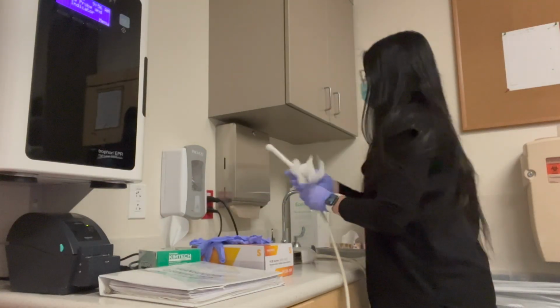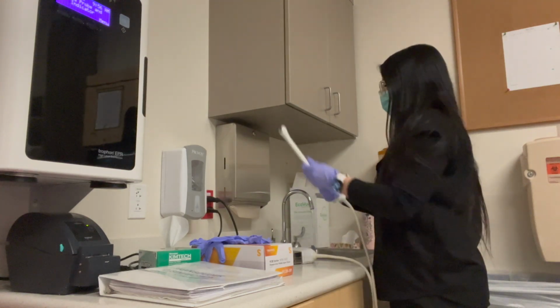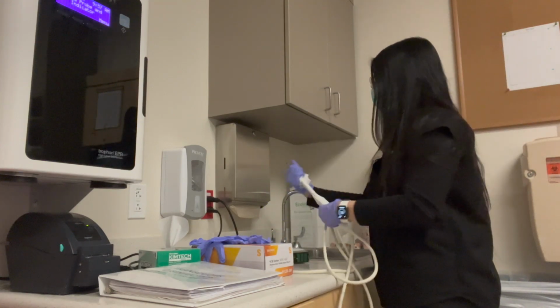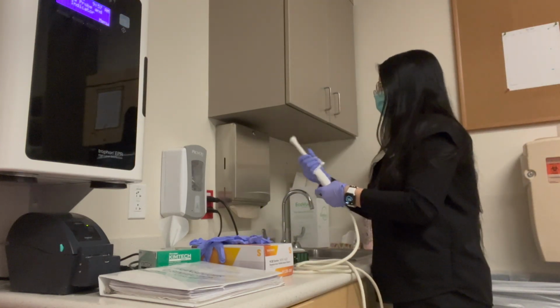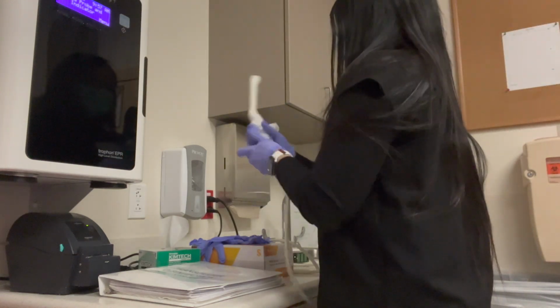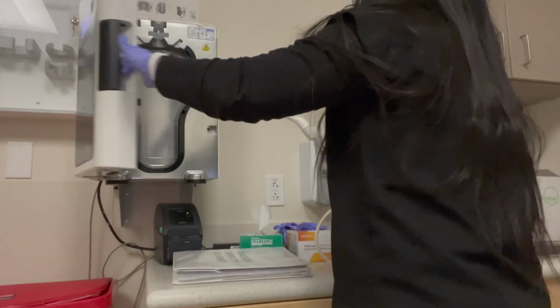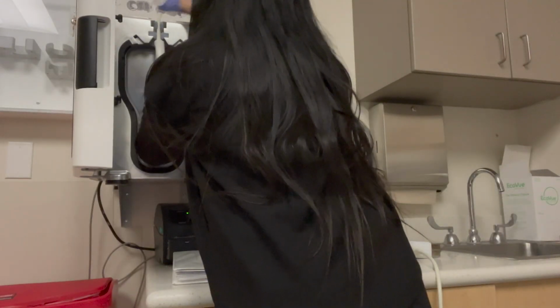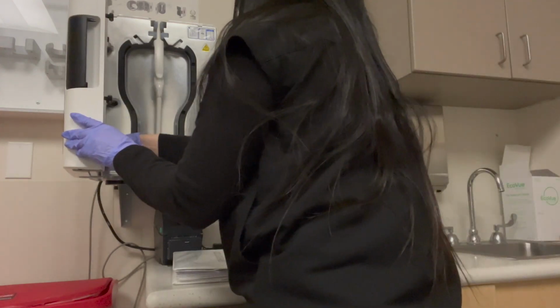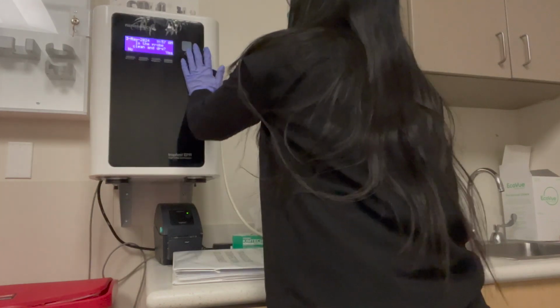The patient I just scanned was a pregnant patient, so I had to clean our transvaginal probe. At my hospital, we typically always do the transvaginal part of the exam if the patient is 13 weeks or less, and if they agree to perform the scan, even if the patient is in pain or has any vaginal bleeding. Otherwise, we only look on top of the belly if they refuse the internal exam. Since she consented to the vaginal scan, we saw really great images of her baby. We make sure that we check the size of baby, the heartbeat, and the ovaries at this early stage.